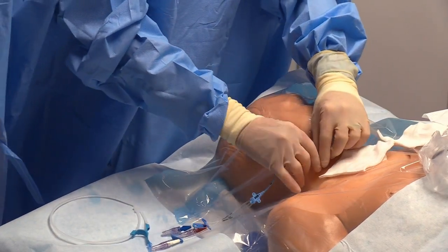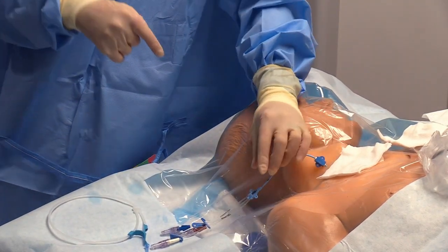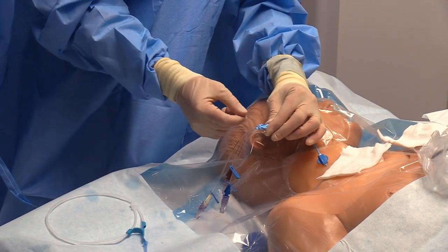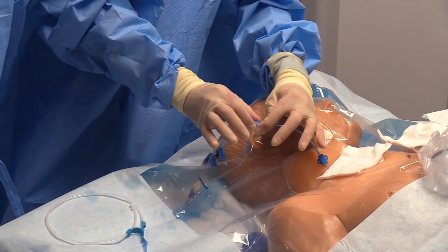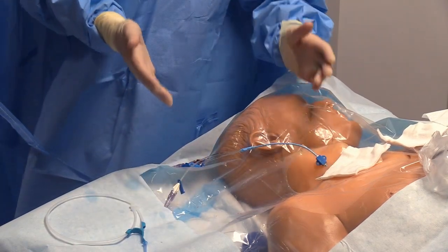So it is much easier to do that if you have it hugged to the hilt, and then you can either just suture these flanges or use an anchor that uses the non-suturing devices to anchor the central line directly from these tips, which we have in our ICU in the emergency department. So these are the ways that I would secure the catheter.